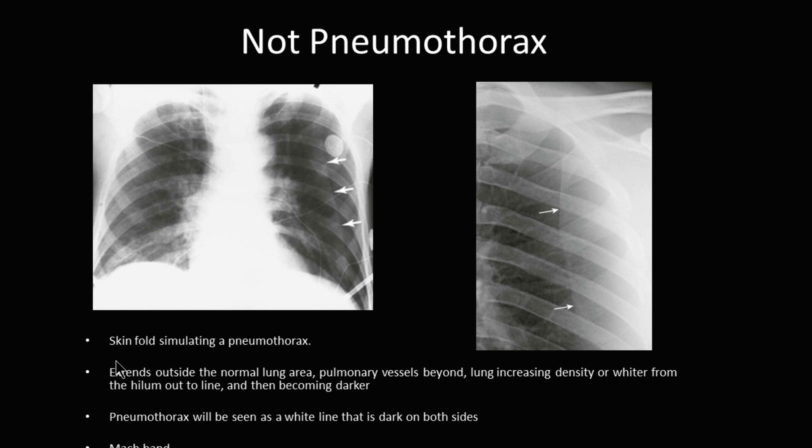What is not a pneumothorax? Skin folds. We push boards underneath individuals during traumas to get a picture, and if they have loose skin across their back, it will fold over — or sometimes there is clothing underneath them — giving what looks like a line. What you need to do is look and see if the lung markings move out past that line. If they do, this is not a pneumothorax.